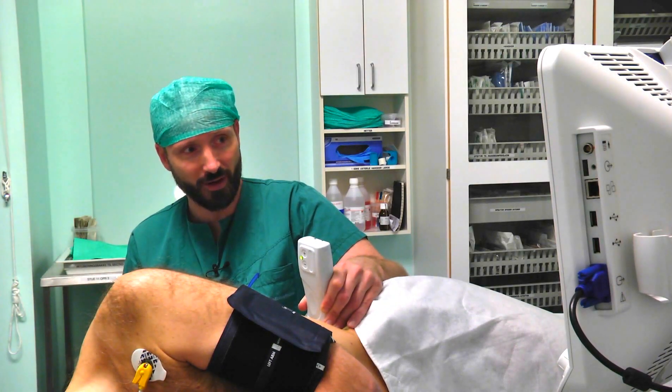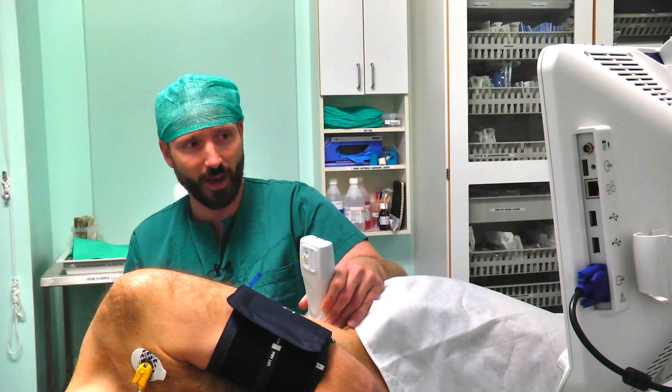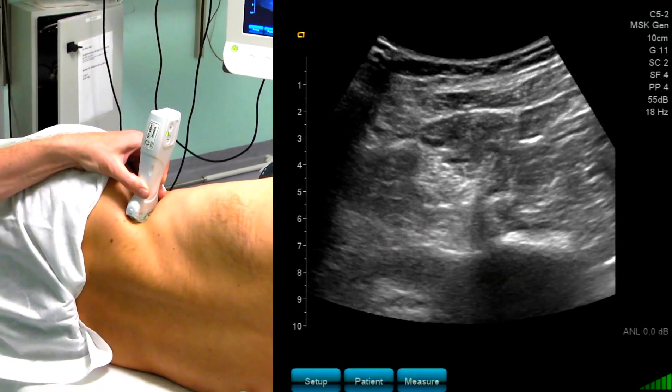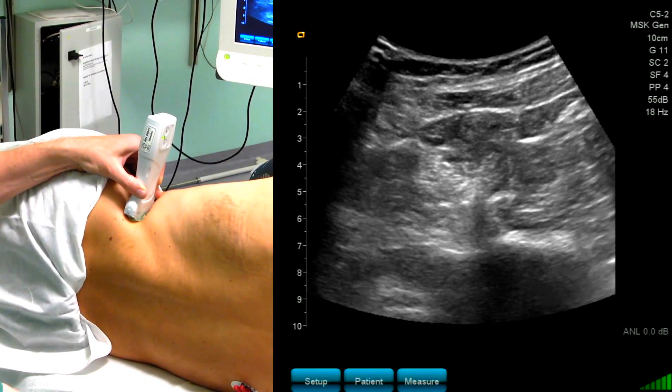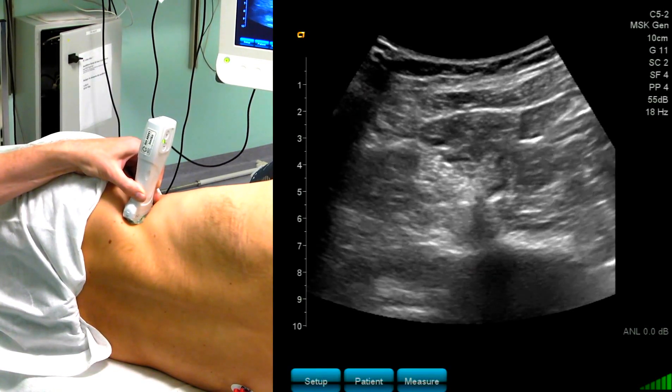To perform the needle block, I want a position where I cannot see the transverse process anymore, because I don't want my needle to get in contact with the transverse process while performing an in-plane needle approach. So I have to move my probe slightly caudally.